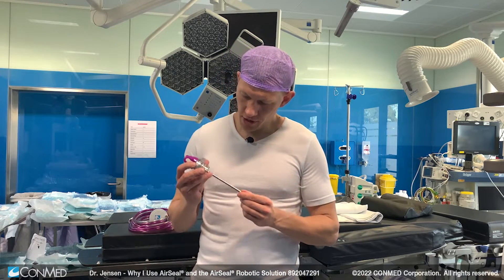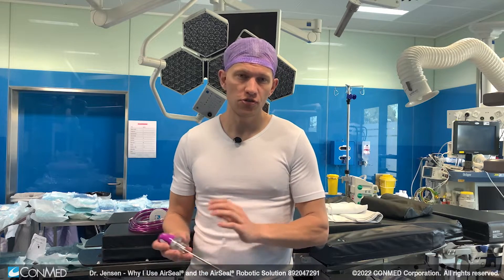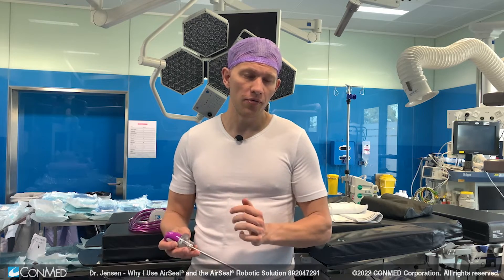About a year ago we started doing robotic surgery here at our center, and I was pleased to find out that AirSeal also provides a robotic solution — a smaller cap placed on top of the 8mm robotic port — which works very nicely and is easily integrated into the robotic system.